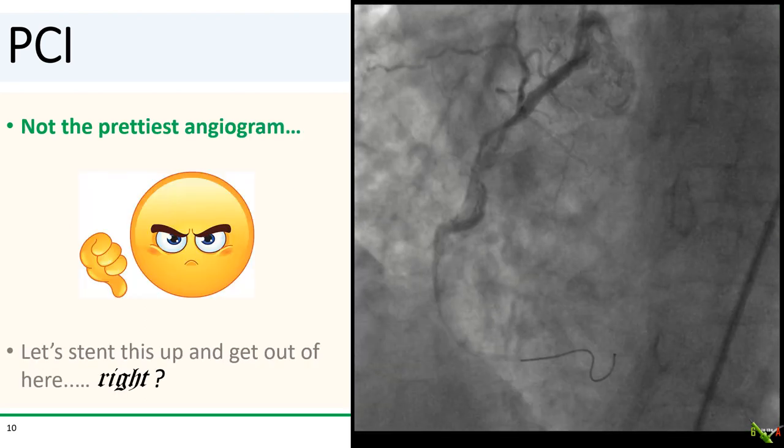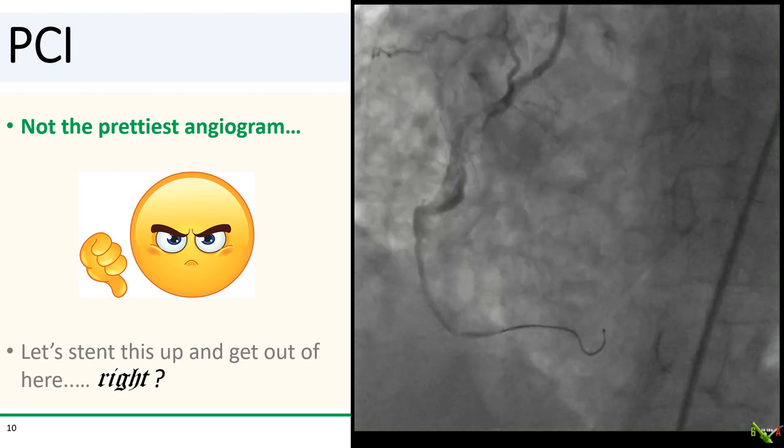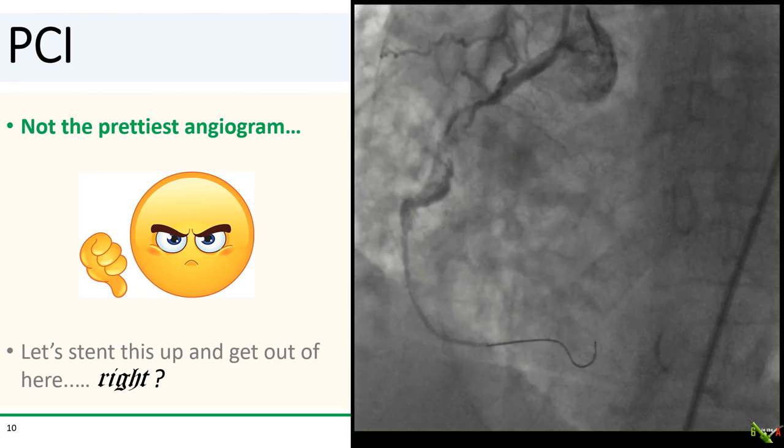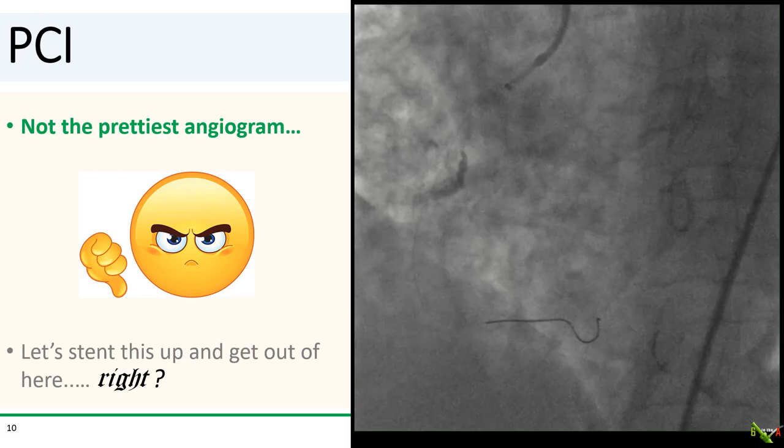We don't want to extend the dissection, so we're going to try to minimize contrast injections. We did do an injection here to help decide on stent length — definitely not the prettiest angiogram. But we have a wire down, so let's just stent this up and get out of here.